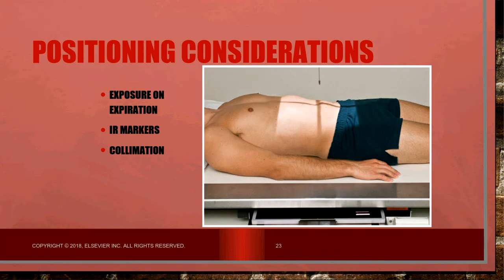You do have to put a marker on the actual image. Remember, we said that it's legal to have the marker on there prior to exposure. And typically we try to use the left marker always, unless it is a right part and the right marker has to be used. The radiologists prefer the left marker as often as it is able to be used.